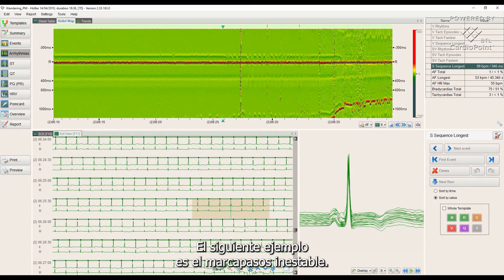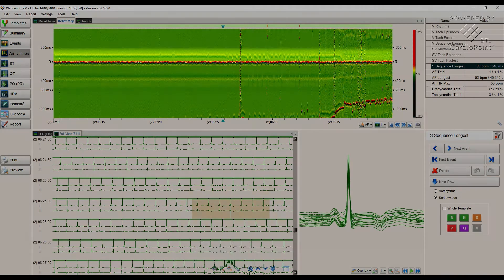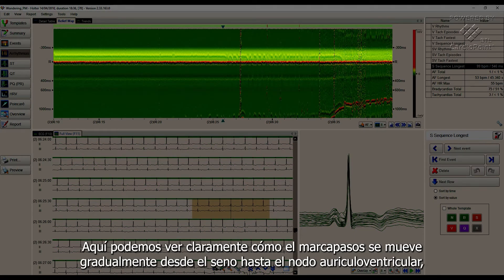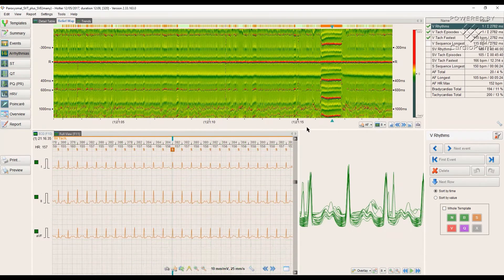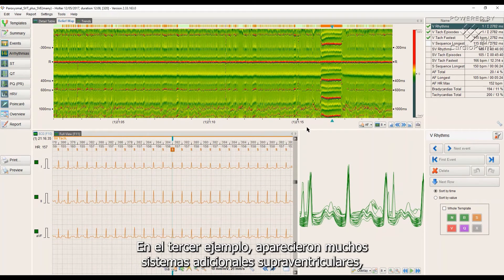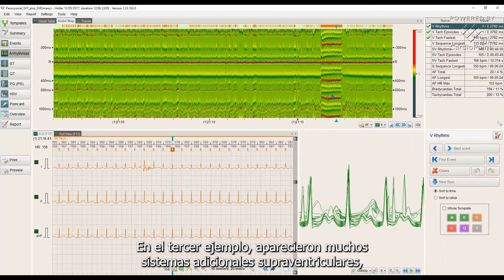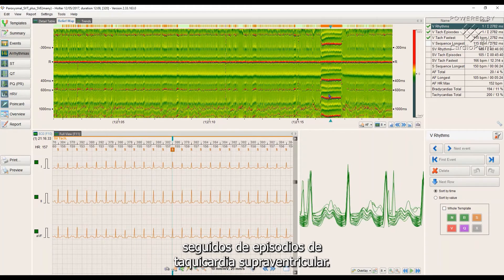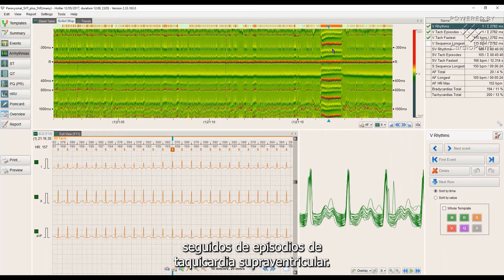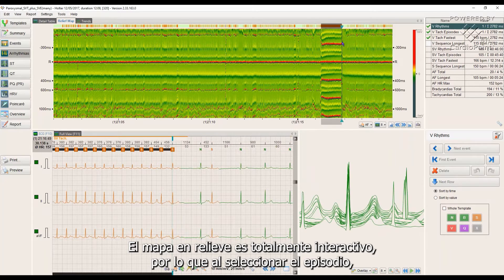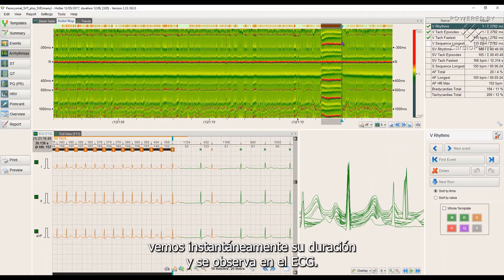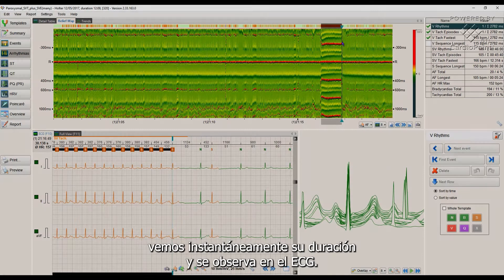The next example is wandering pacemaker. Here we can clearly see how the pacemaker gradually moves from the sinus to the atrioventricular node, which is a much harder symptom to catch on the ECG curve. In the third example, lots of supraventricular extrasystoles appeared, followed by an episode of supraventricular tachycardia. The relief map is fully interactive, so by selecting the episode we instantly see its duration and observe it on the ECG.